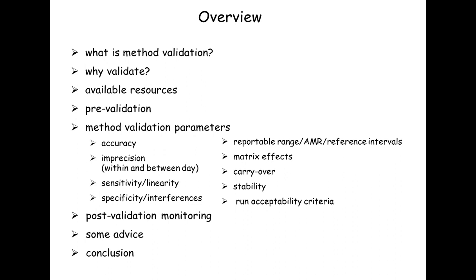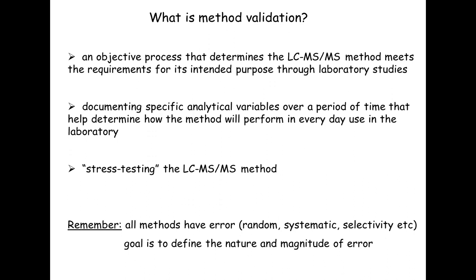To give you an overview of what I'm going to talk about today, we're going to cover what method validation is and why we should validate our methods. We'll quickly cover some available resources, and then we'll go into what pre-validation is, and then the majority of the presentation will be on the method validation parameters. We'll talk about post-validation monitoring, and then I'll give you some advice from someone who's probably done it the wrong way more times than she'd care to mention.